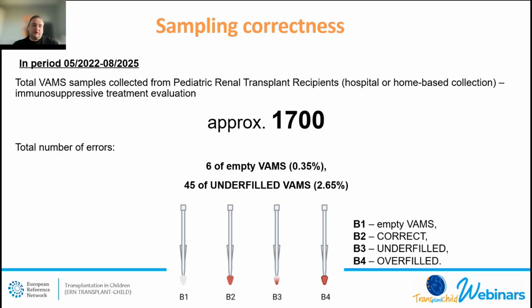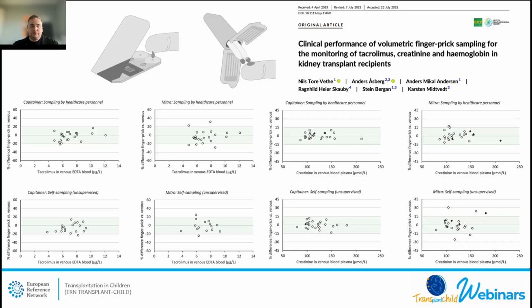In the case of 45 samples, we found that the tip was not fully loaded, so these results cannot be used for clinical decisions.